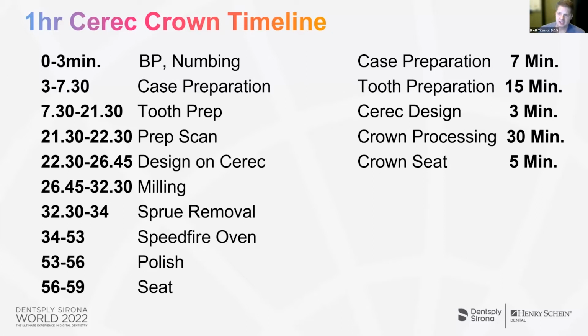The technology has gotten so good that your initial proposals, the algorithms that it produces with the crown, come out really, really good. There's only a few steps and things I do when I'm designing that crown that I'll make some adjustments to, but the technology has really come a long way in those initial proposals. So it does not take a lot of time or a computer engineering degree to sit in front of a CEREC and design a crown anymore. Especially if you get a good prep and enough clearance.